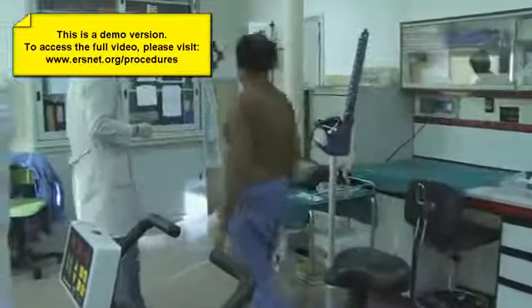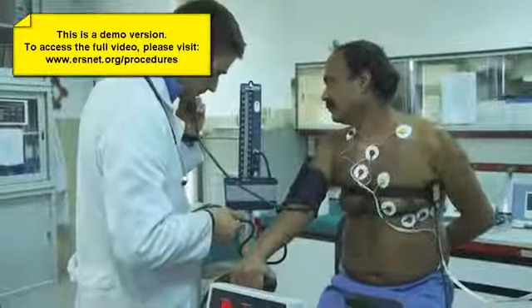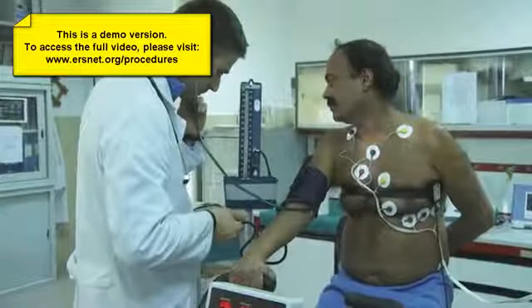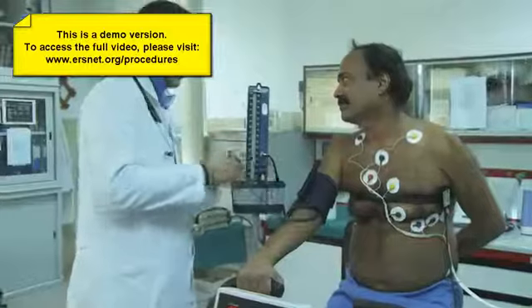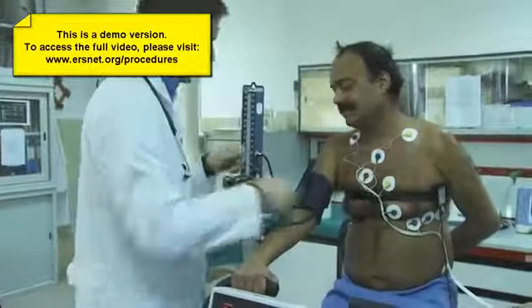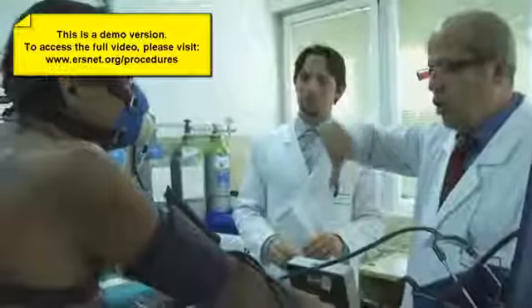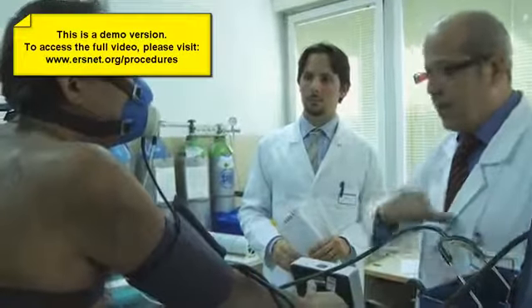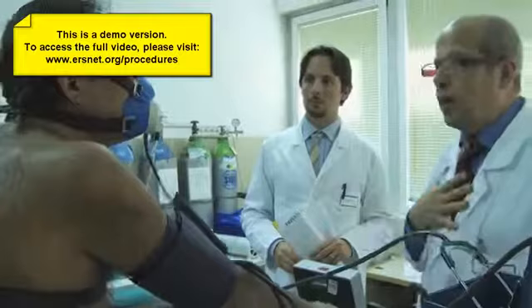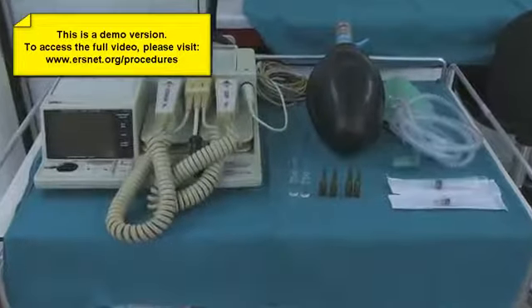CPET should be carried out in a quiet environment. The suggested room temperature is 20 degrees centigrade. CPET should be conducted by adequately trained personnel with basic knowledge of exercise physiology, and performed under the supervision of a physician trained in cardiopulmonary resuscitation.